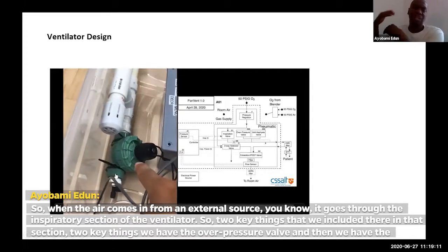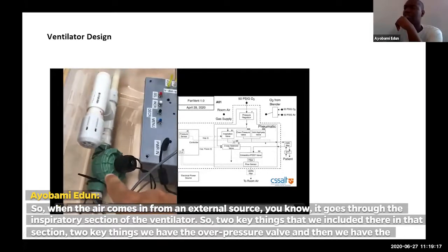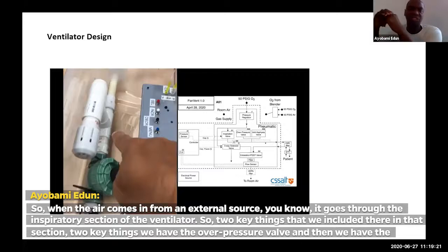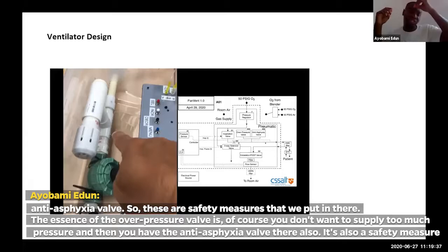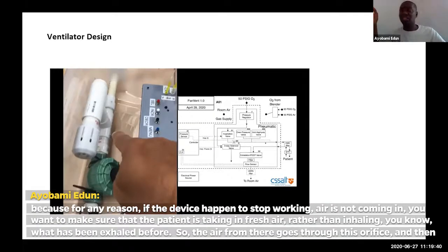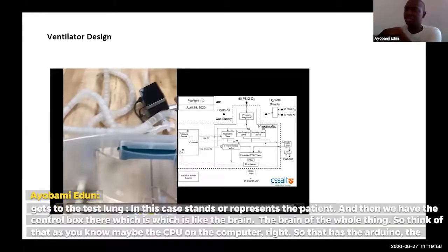When the air comes in from an external source, it goes through the inspiratory section of the ventilator. Two key things that we included in that section: the overpressure valve and the anti-asphyxia valve. Those are just safety measures. The essence of the overpressure valve is that you don't want to supply too much pressure. The anti-asphyxia valve is also a safety measure, because if for any reason the device stops working and air is not coming in, you want to make sure that the patient is taking in fresh air rather than inhaling what has been exhaled before. The air from there goes through this orifice and then gets to the test lung.